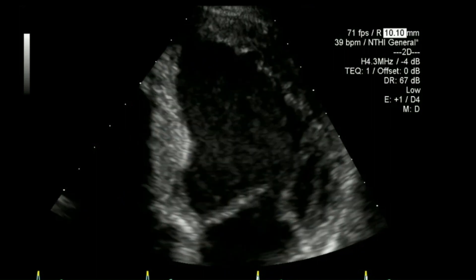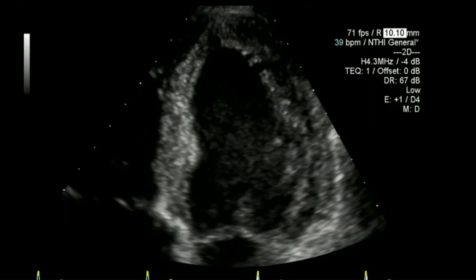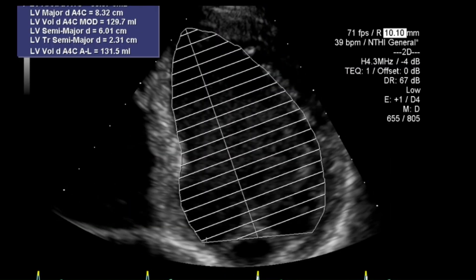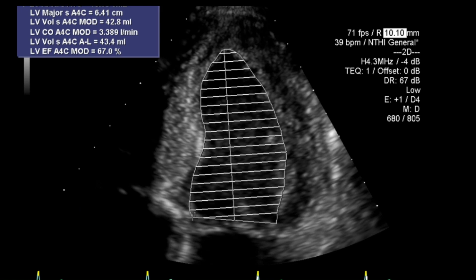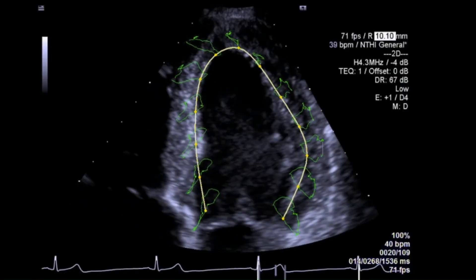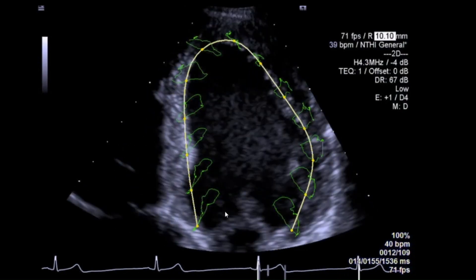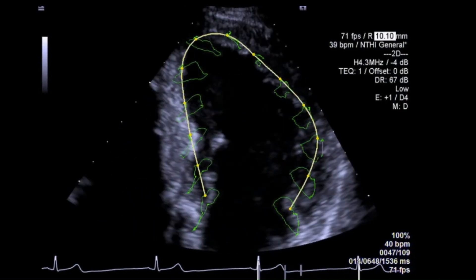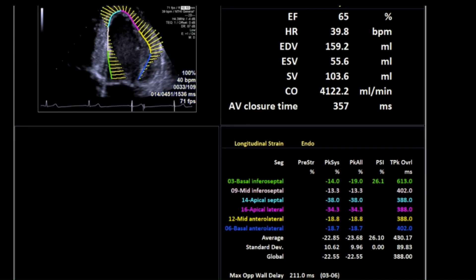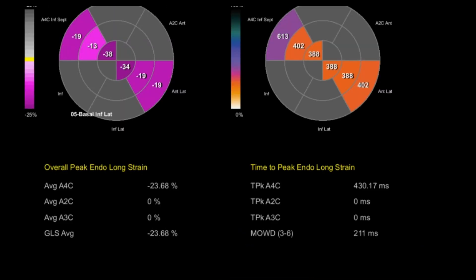Looking at end diastolic volume and end systolic volume — a normal ejection fraction — and then left ventricular global longitudinal strain looking at endocardial strain, with quite normal numbers here, normal being over negative 23%.